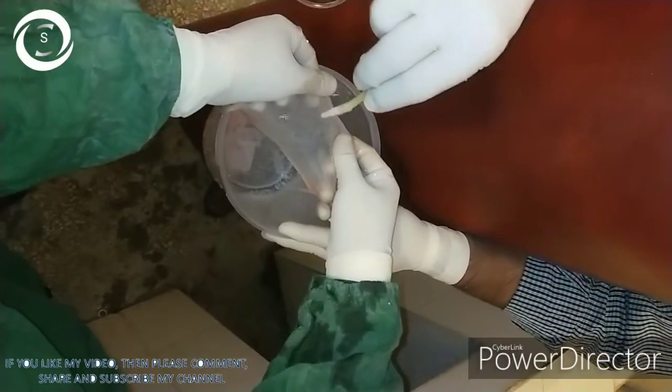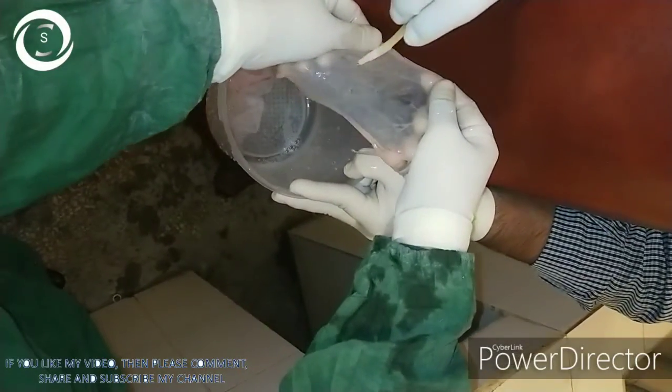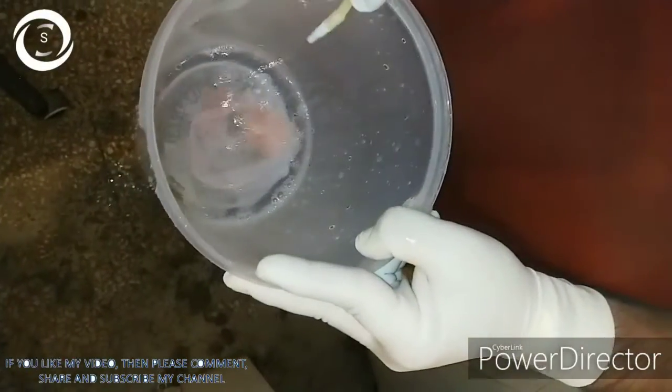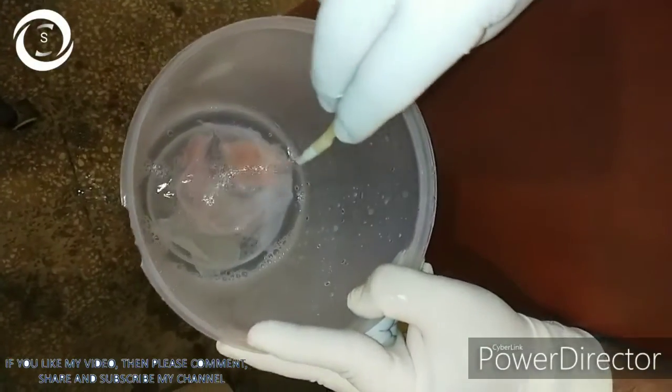You can see in the video that after cleaning it with tap water, we are now cleaning the amniotic membrane with balanced salt solution.